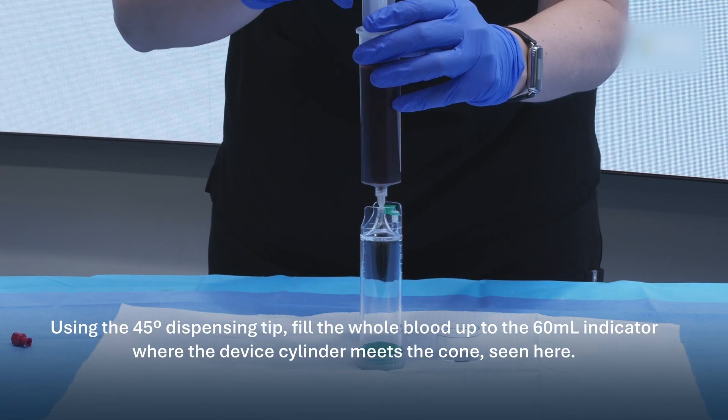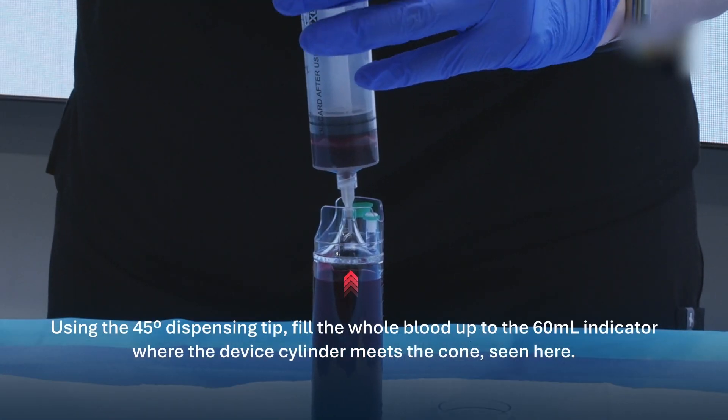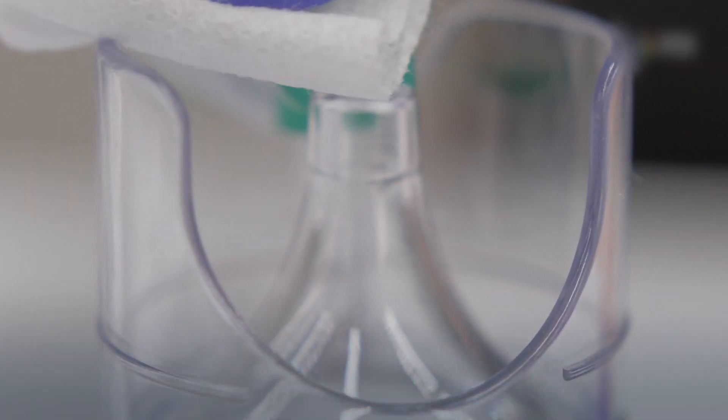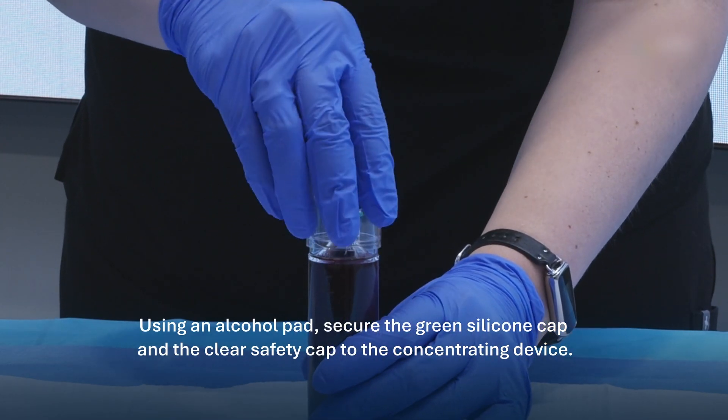Using the 45-degree dispensing tip, fill the whole blood up to the 60 milliliter indicator where the device cylinder meets the cone, seen here. Clean using an alcohol pad. Secure the green silicone cap and the clear safety cap to the concentrating device.